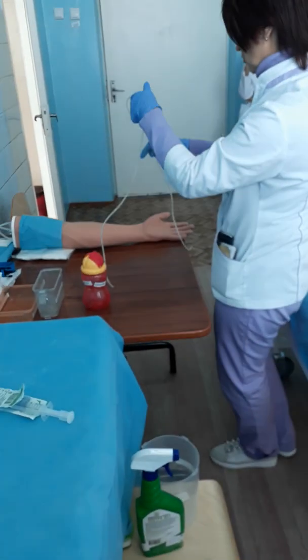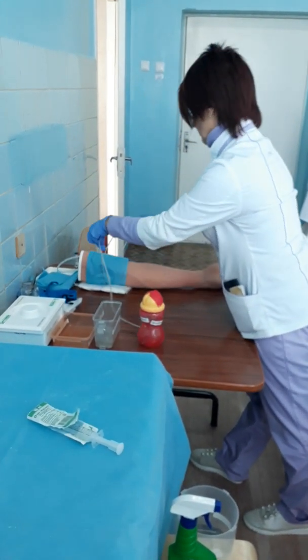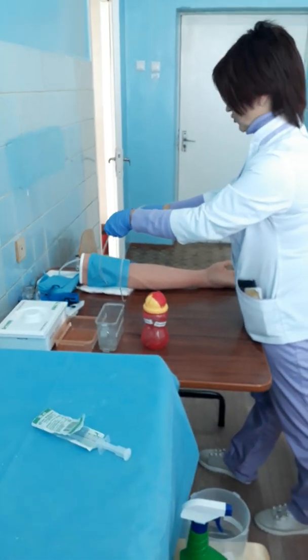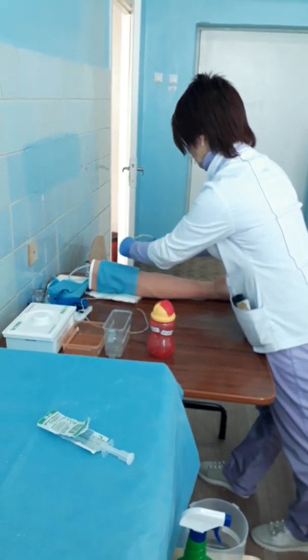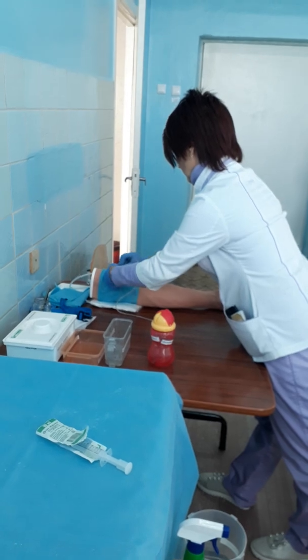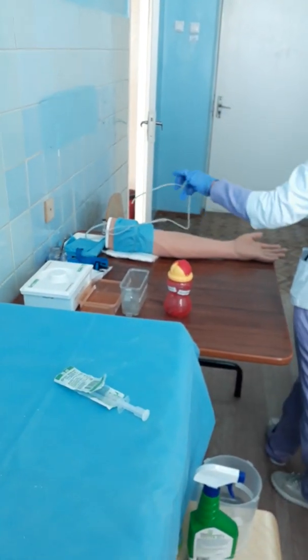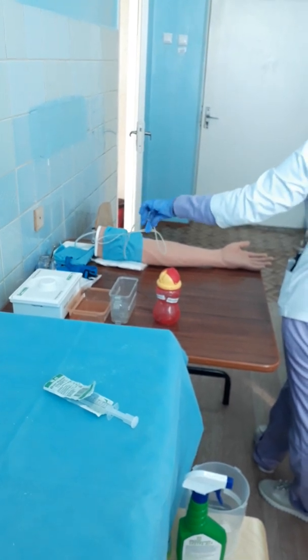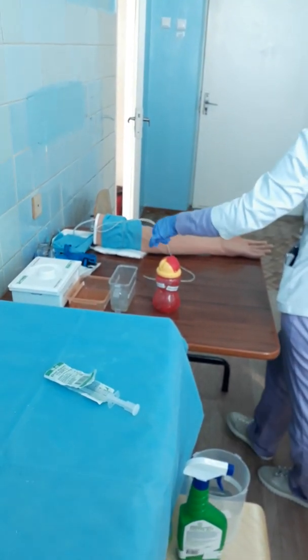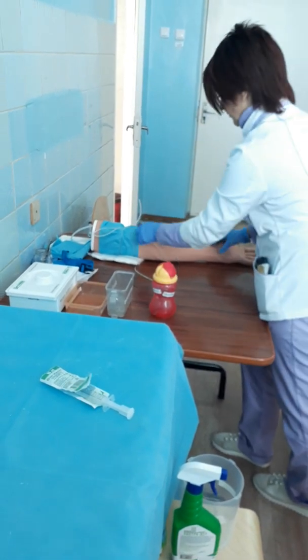Now I can show you how it must be. Lay this tube around, turn this tube around the hand, and after that, understand, yes? When you need, you can remove it using only one hand.